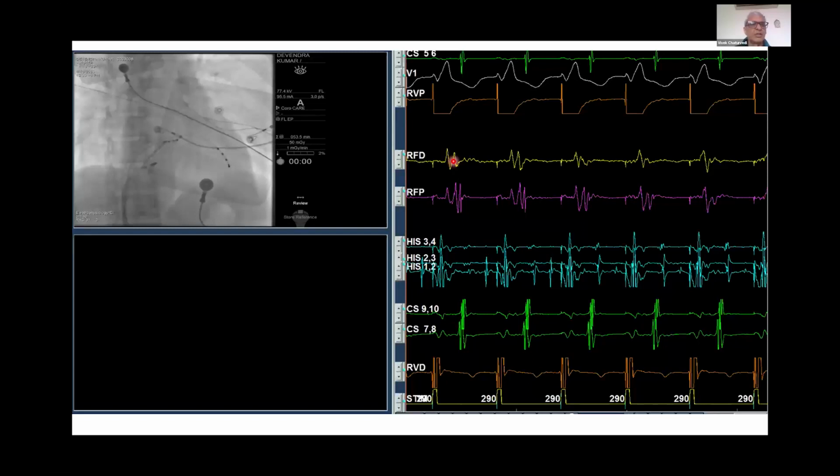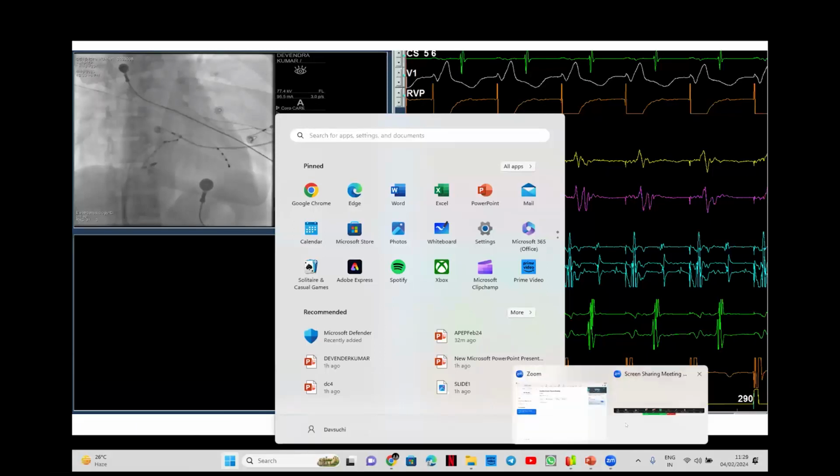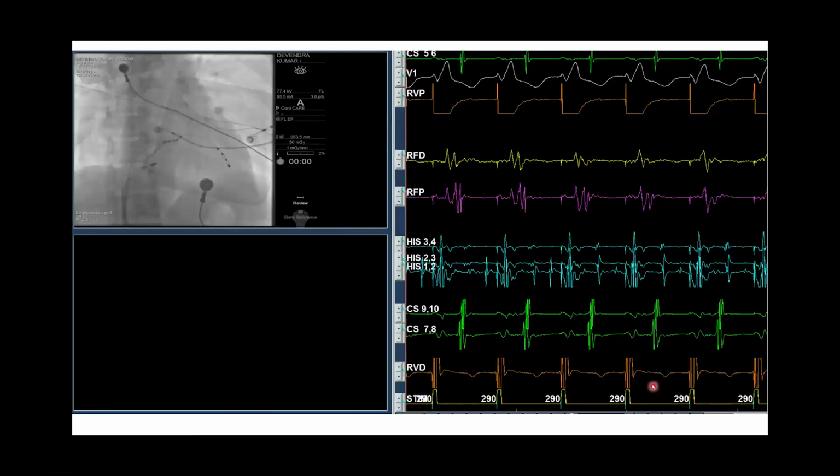Thanks. And I think that although it's probably not strictly with the EP features of the lab, it's well to remember that the positioning of the distal CS may be atrial, ventricular, or on the AV groove. So one cannot be totally going by the CS signals. One has to look at the endocardial signals also. And Dr. Kapil or John, do you have anything else to comment on this? Just one quick comment that the signal amplitude, the A versus V, also changes with V pacing and sometimes with the onset of tachycardia.